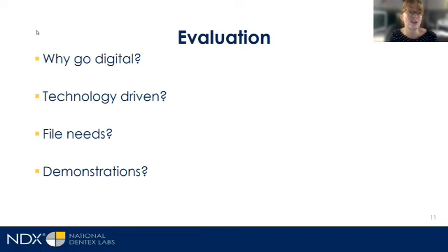What else? Are you technology driven? Most people today are pretty techie, and they enjoy being able to showcase that technology expertise in their work environment as well as their personal environment. And what are your file needs? So I know we're a lab, right? But there are file needs with intraoral scanners if there's any aspect that you don't want to send that file directly to a lab. Maybe you want to send it somewhere else for some sort of an evaluation. Maybe you're going to be combining it with CT scans and preparing surgical guides. Maybe you're looking at some sort of in-office milling, things along that line.